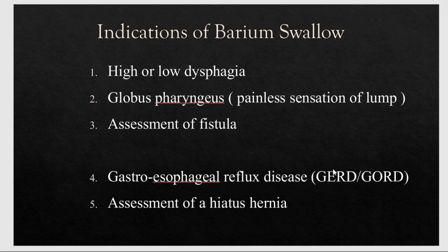doesn't mean tracheoesophageal fistula. Usually, as this barium has a very high density and thick viscosity, and there is risk of aspiration of barium, as we discussed in the first video, it must be avoided in tracheoesophageal fistula. But yes, for pharyngocutaneous or esophagocutaneous or gastrocutaneous or enterocutaneous fistulas, these studies are indicated, right?